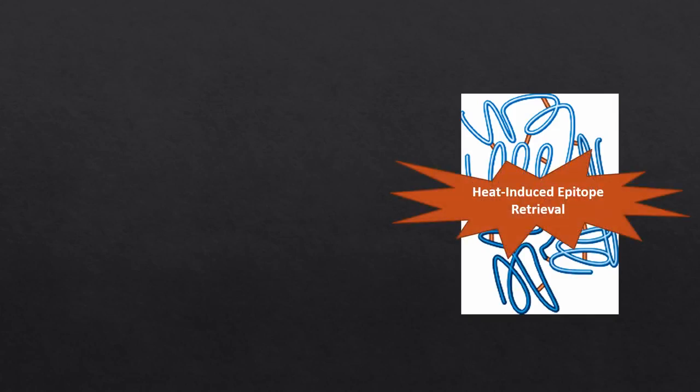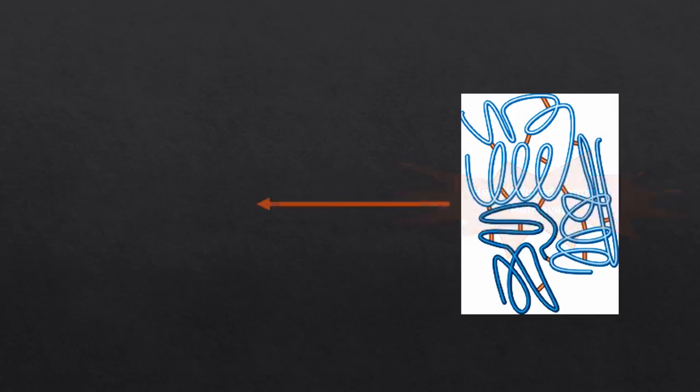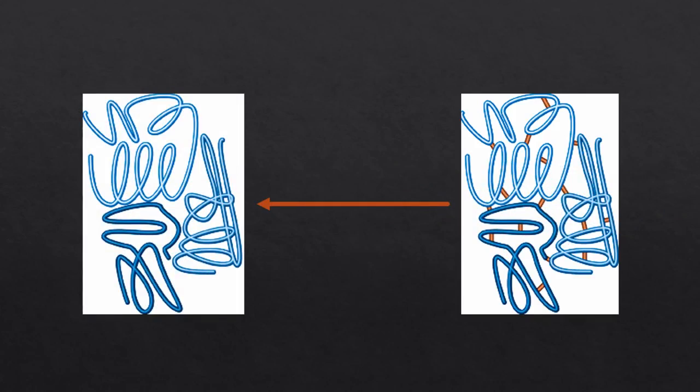This actually causes most of the formalin bridges to break down and unmask epitopes with great efficiency. After rehydrating the tissue sample, HIER is performed to unmask epitopes so that IHC procedures can be utilized. A proper pH buffer is used to heat the tissue, which is optimally around 8 to 9 in range.